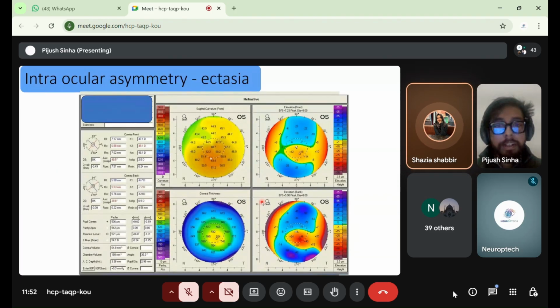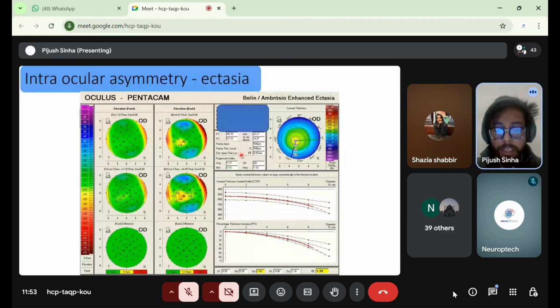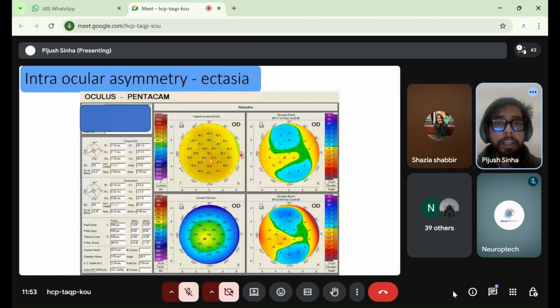We have another question by Annapurna. Is refractive surgery a corneal ectasia condition? No, refractive surgery is a cosmetic procedure. For refractive surgery, first of all, we need to do a proper, detailed, comprehensive eye examination, including vision, refraction, cycloplegic refraction, and retina evaluation. Pentacam plays a vital role here. All the values should be normal. If any value is found to be abnormal, like the thickness is less, then ultimately the residual stromal bed thickness will be less. So it is a contraindication at that time.